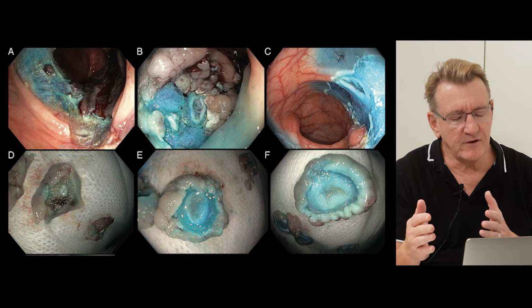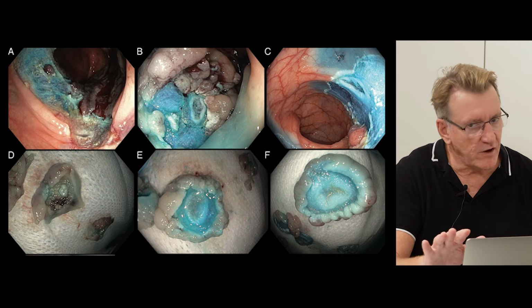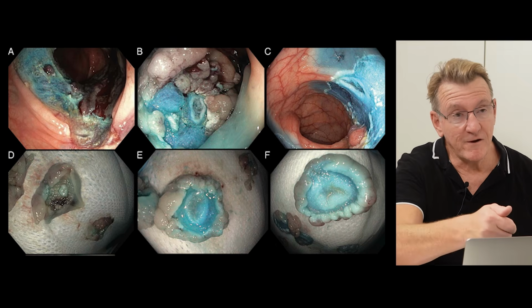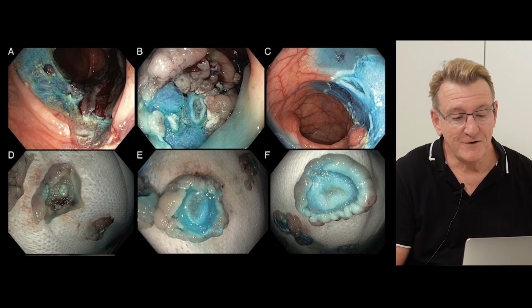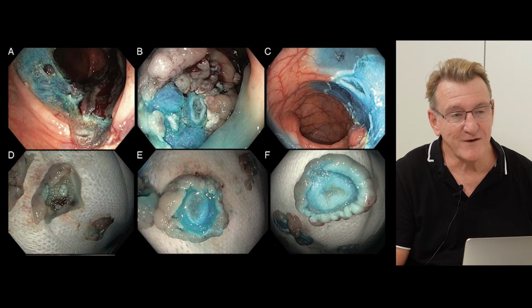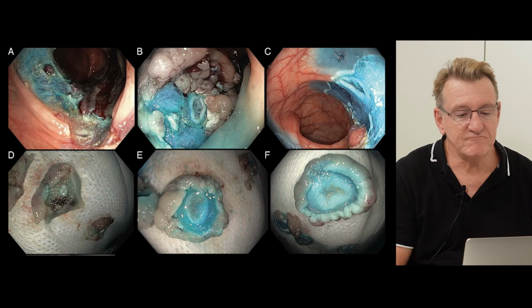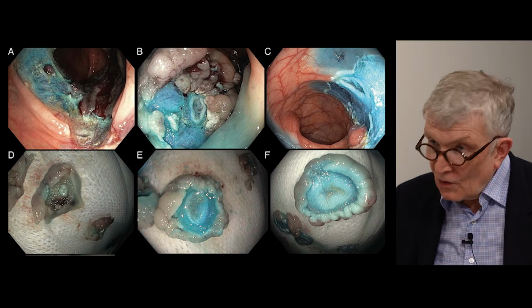It takes more taps to go through, and then you see the defect. You mightn't see a hole or a type 3 injury, but if you take the specimen and turn it over intraluminally with the snare, if you see this appearance, you know that you've excised muscle, and sometimes it's just the tiniest bit. And so this patient has a type 3 injury and is at serious risk of a delayed perforation. Again, closure, of course.